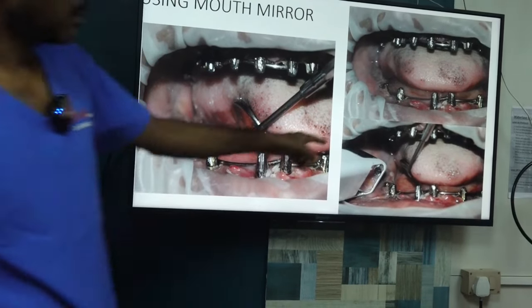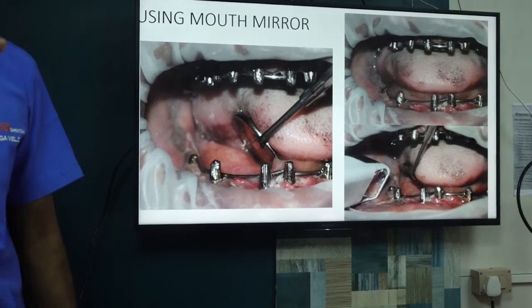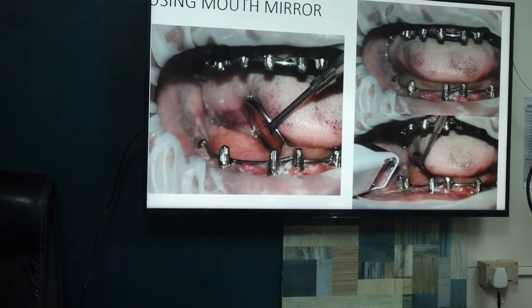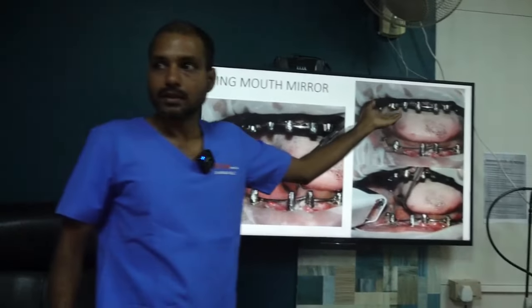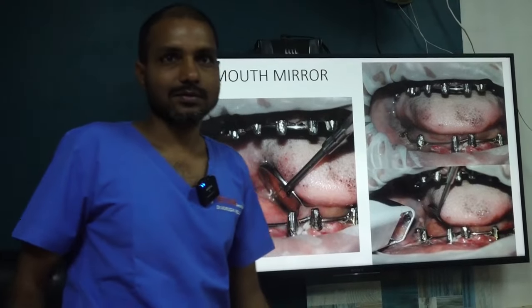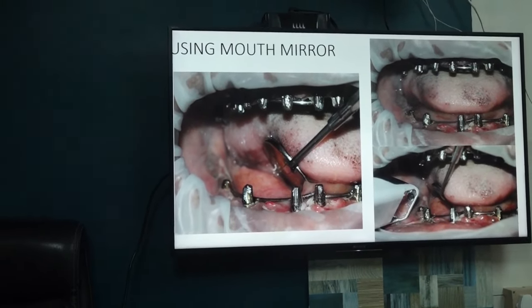Okay, see, in many patients the floor of the mouth will rise and come up to the implant head. In some patients it won't, in some patients it will. In extremely resorbed patients, the floor will seem higher. Actually the floor is not coming higher, the ridge has gone down. Okay, the ridge has resorbed down. Okay, the next.